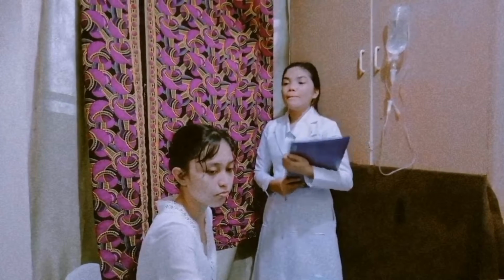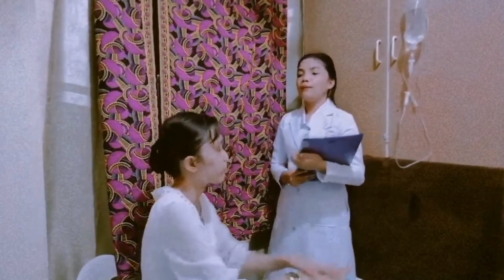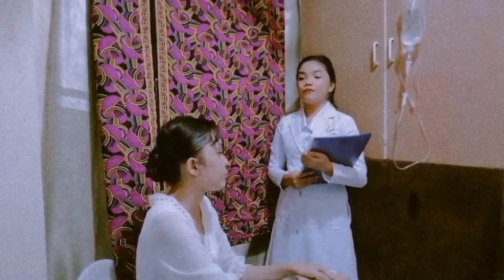So good day ma'am. My name is Ivy C. Cabilin, your student nurse for today. So I am going to perform an IV infusion.